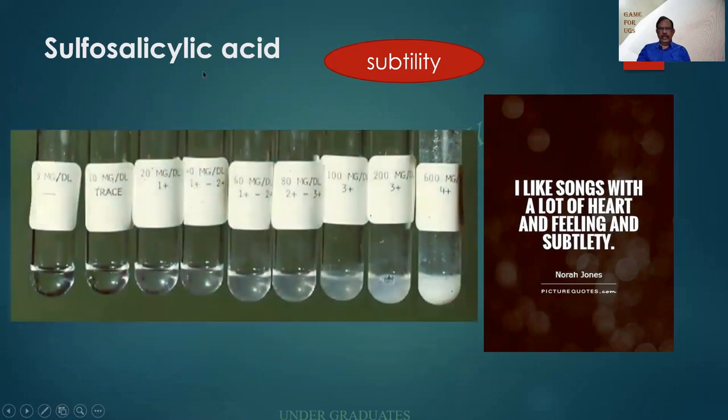Look at this one over here, sulfosalicylic acid. I hope you people are able to identify where the precipitate starts and where it ends. Ending is obvious, but then where it starts, you people can make out by yourself. Look at this one, trace 1 plus so on till 4 plus. The grading, I would like you people to answer. Definitely, I will ask you in the exam.